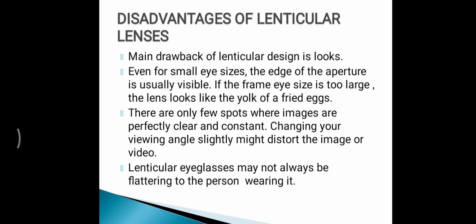If you want to see the disadvantages, the main drawback of the lenticular lens is the looks. It doesn't look good at all. Even for small eye sizes, the edge of the aperture is usually visible. If the frame size is too large, then the lens looks like the yolk of a fried egg. It really doesn't look good. There are only a few spots where images are perfectly clear and constant. Changing your viewing angle slightly might distort the image or video. And lenticular eyeglasses may not always be flattering to the person wearing them.